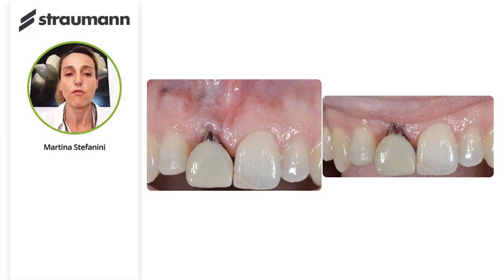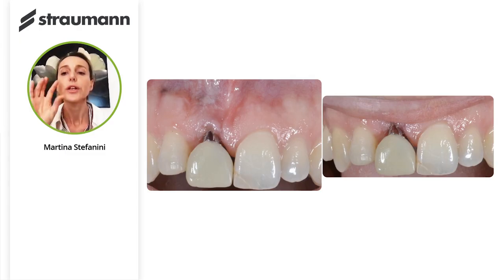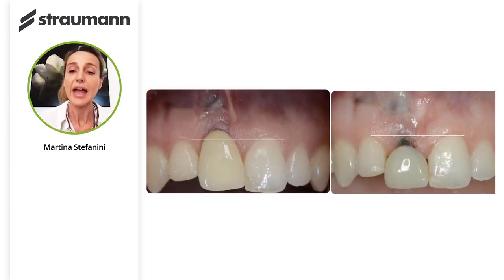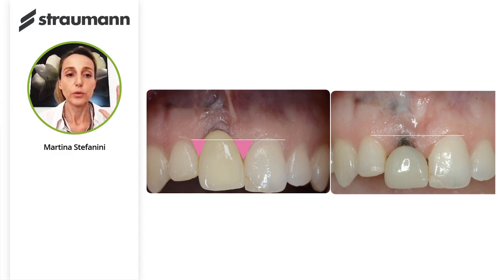So the first step of our procedure, which is the so-called combined prosthetic mucogingival procedure, is to remove the old crown, to reduce the abutment, and to place a short provisional crown in order to let the interproximal soft tissue regrow and occupy the interproximal space, in order to increase the quantity of vascular supply that we have for our coronally advanced flap. So you see the patient during the pre-surgical prosthetic phase with the short provisional crown in position. And you see the differences now with respect to the baseline situation.